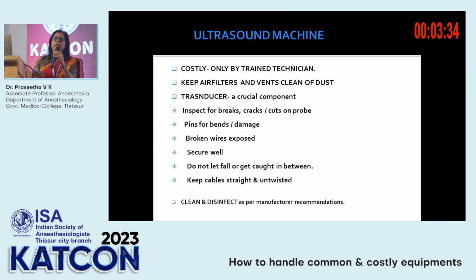So coming to another costly equipment which we commonly use in our OTs now, the ultrasound machine. It is costly and it is sophisticated to use and assemble. So whenever you are using an ultrasound, if you are not trained in using this machine, seek the help of a trained technician rather than handling it without knowledge.